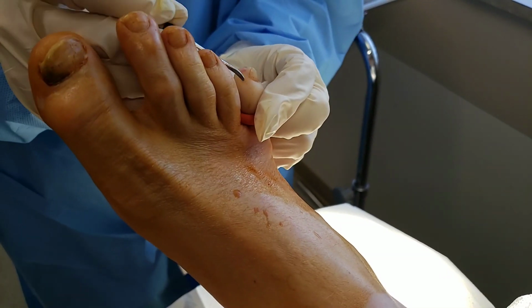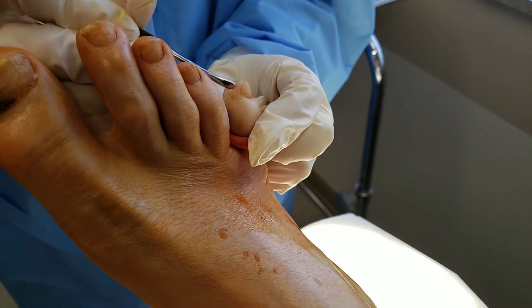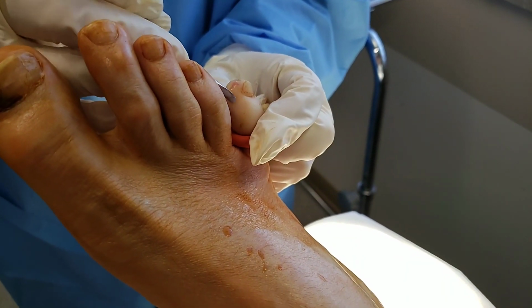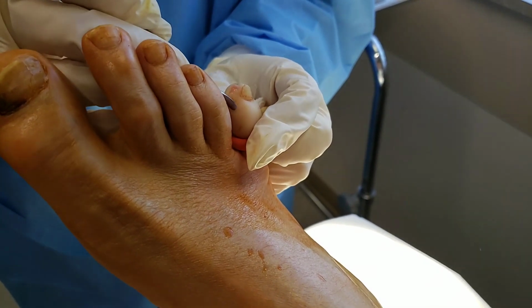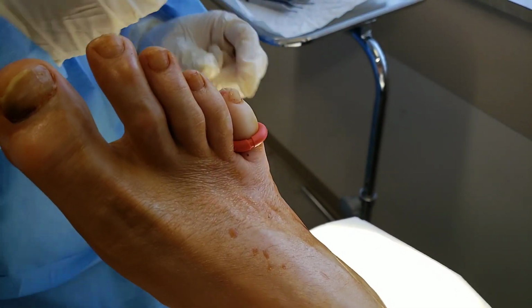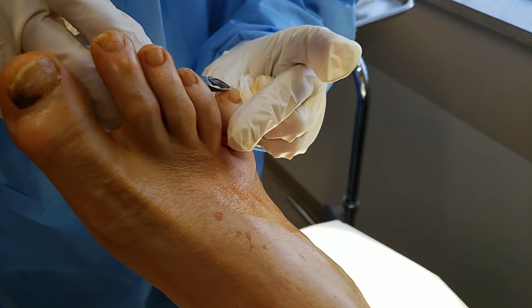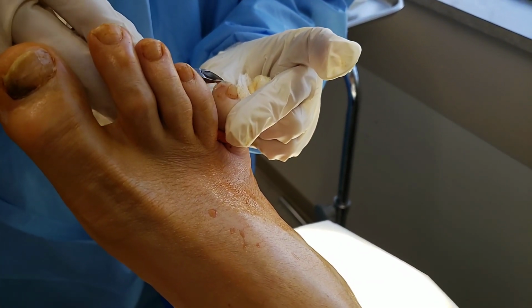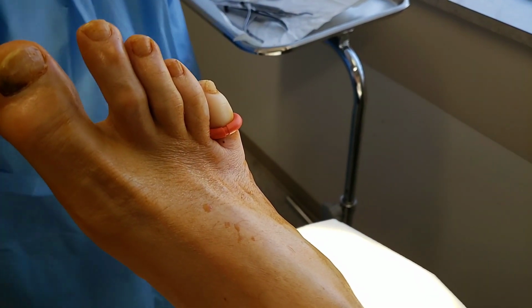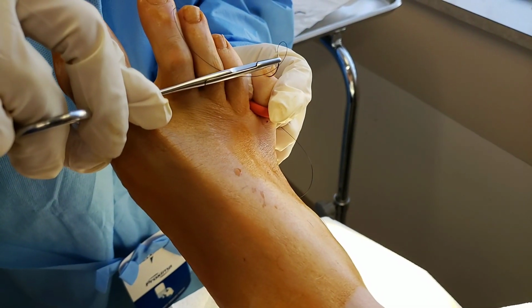Now what's the risk of this? Well, one is you shave it right here, so it potentially could rub a little bit further closer or a little bit further away. Less further away, but sometimes closer if this bone on the other side is too large. Okay, but usually this resolves this type of a problem right there. What we're going to do is we're going to put a couple of stitches in here, and then we'll be done. And the only thing that this patient has to do is he can't get it wet for a couple of weeks until the skin heals.